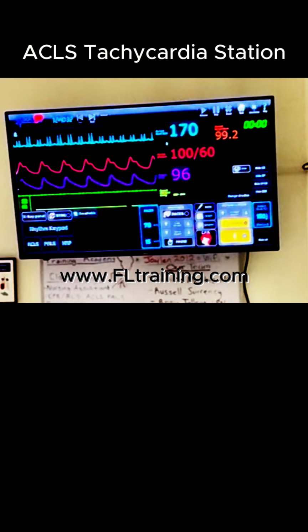And when we give it, usually the heart rate will slow down, but I think this patient just had too much caffeine in her system. She was drinking too many energy drinks. So when you gave her adenosine, her heart rate went up more, but we need to look at more than just the heart rate. Do you need any other new vitals? Anything else on this monitor? We can give another.